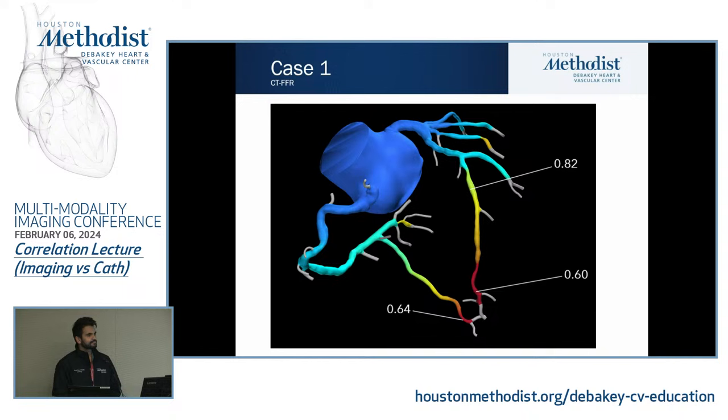If you consider the lesion to be severe on the initial CT, then you don't really need to do the FFR CT, at least for the majority of cases. So I'll give you how things are in the guidelines, and it's not my personal opinion. Per the guideline, this would justify going to FFRCT because it says anything from 40 to 90%. And this is based on invasive data that shows that even lesions called 70 to 90 on QCA by Cath, a good percent of them did not correlate with invasive hemodynamics. So that's why they push for it to be done in this one.